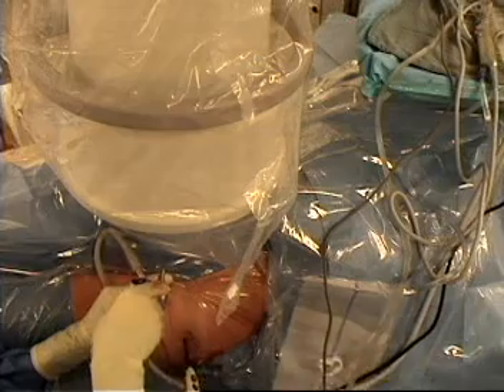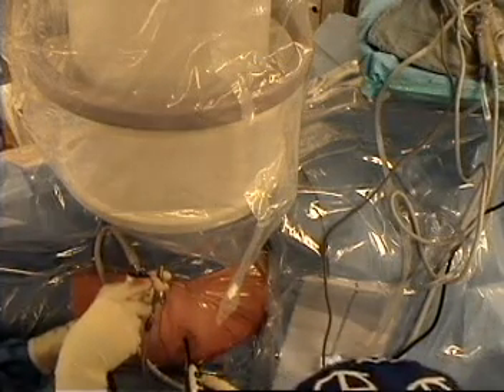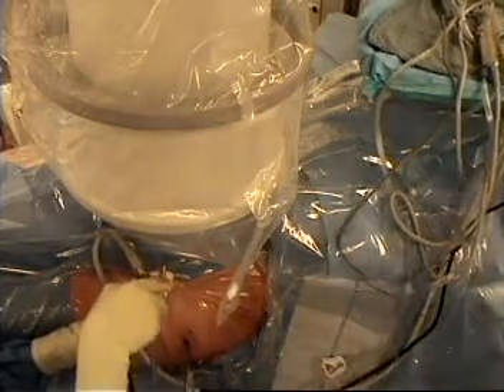So this is what we are doing. We are just opening up the capsule. It looks really good. We are going to look inside the hip now. Once we open up the capsule like that, we are going to look inside the hip.